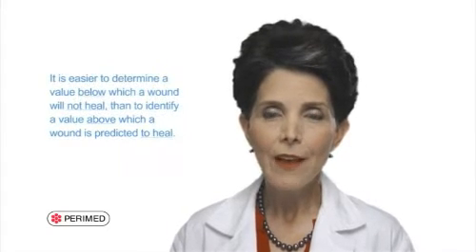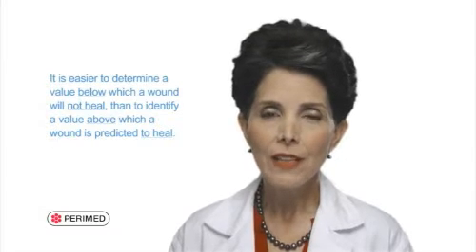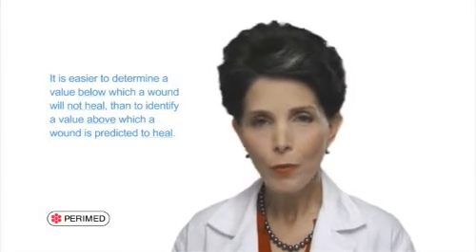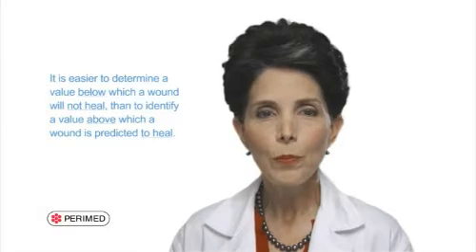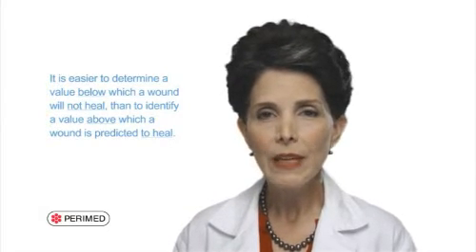Because tissue hypoxia leads to healing failure, it is easier to determine a value below which a wound will not heal than to identify a value above which a wound is reliably predicted to heal. This is because wound healing can be impaired by many factors other than hypoxia, such as the patient's nutritional status, diabetes control, medications, and many other things.